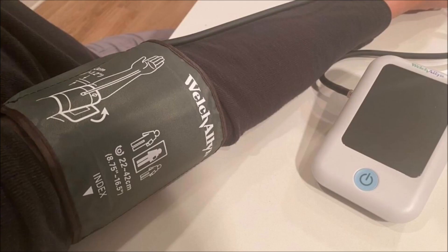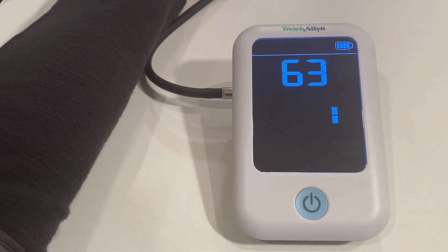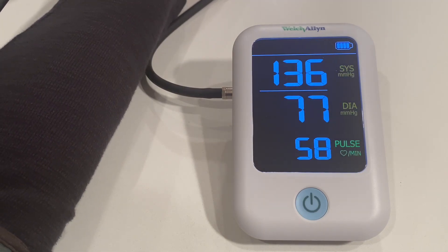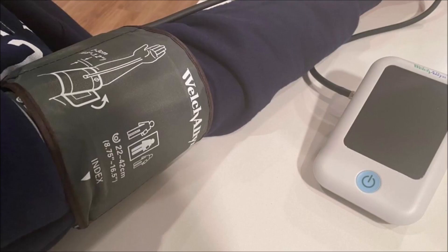The second measurement was done with the cuff over an average thickness long sleeve shirt. This measurement took longer and the result was 136 over 77 — a 15 point increase over the bare arm.